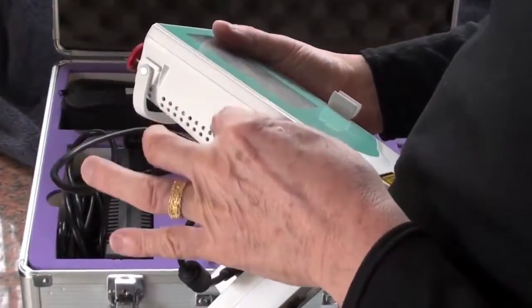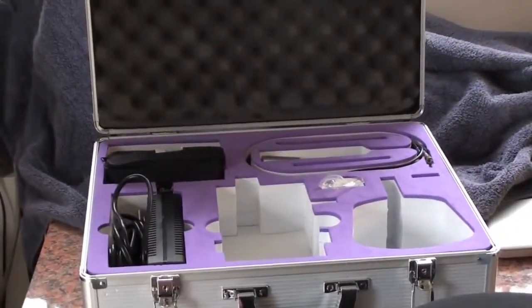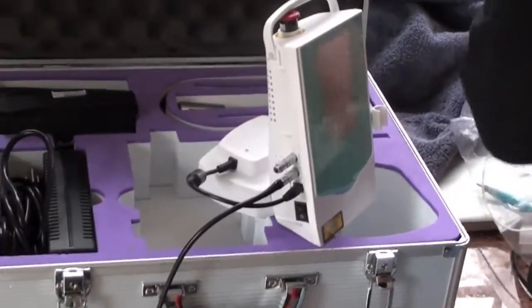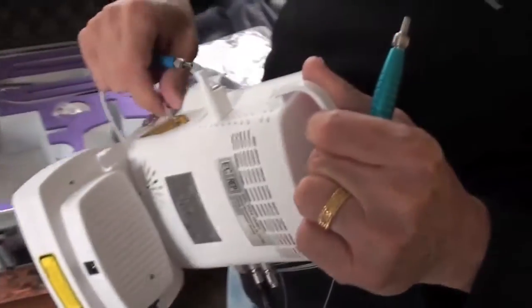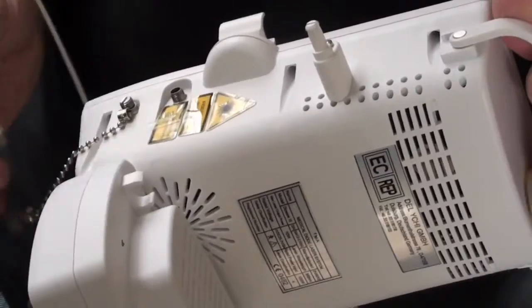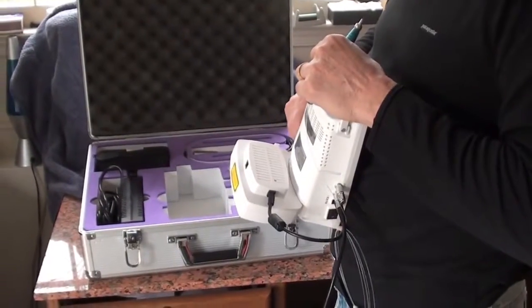Remember the red, I'm looking for the red, and you stick it in here, 12 o'clock high. There we go. Then we're also going to hook up the fiber. Again, there is a wheel that comes with this. It comes with every laser. However, I prefer the way it's set up like this. Much easier. But you can use the wheel. They both work well. You always keep off the metal connector because you don't want to get any dirt or lint in there. So when you're not using it, you put the covering over it. You put this in, it should be finger tight. And we're ready to turn it on in a minute.